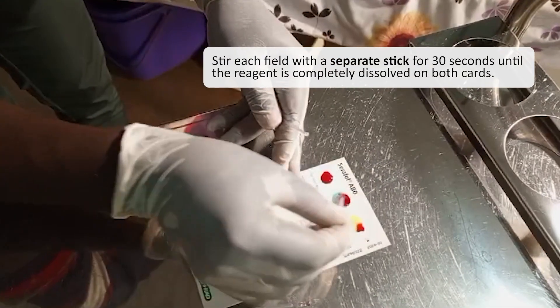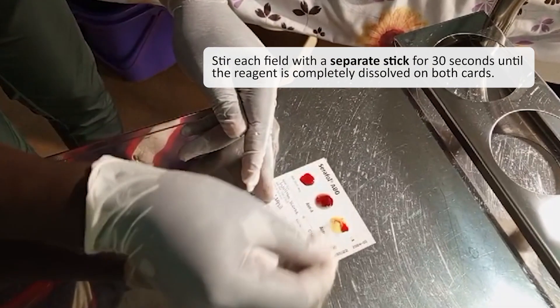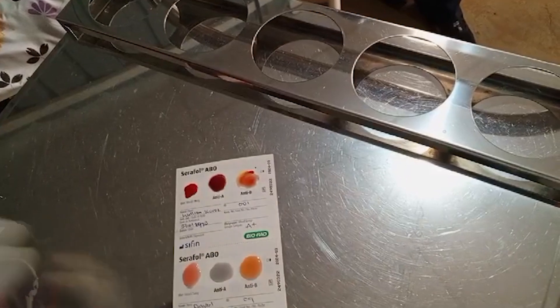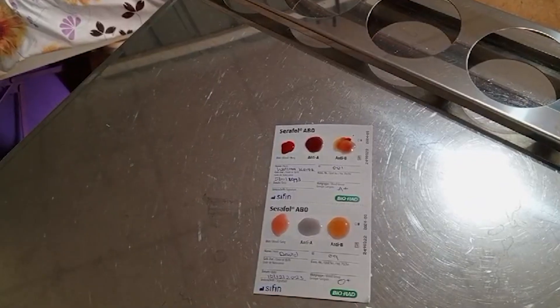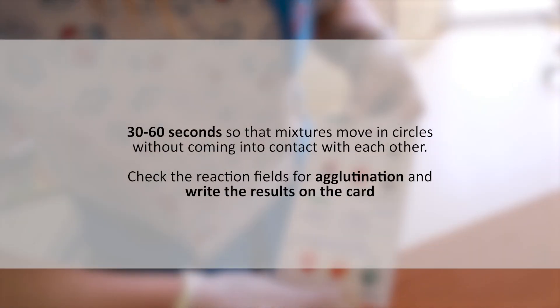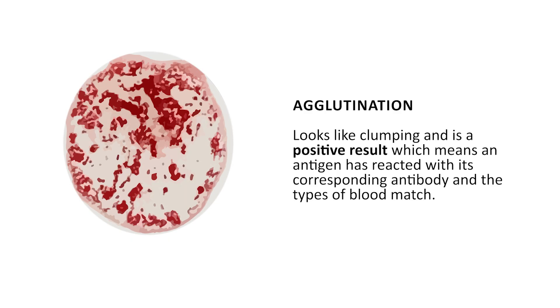Stir each field with a separate stick for 30 seconds until the reagent is completely dissolved on both cards. While mixing, spread the material to be tested over the entire reaction field. Gently agitate the card, rotating it back and forth for about 30 to 60 seconds so that the mixture moves in circles without coming into contact with each other. Check the reaction fields for agglutination and write down the results on the card. Remember, agglutination looks like clumping and it is a positive result, which means an antigen has reacted with its corresponding antibody and the types of blood match.